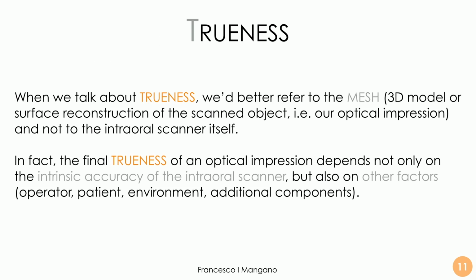And when we talk about trueness, we had better refer to the mesh instead of the intraoral scanner itself, because obviously there can also be deviations, some kind of standard deviation, among the different meshes of the different objects captured with the same intraoral scanner. So it's very important to say that the final trueness of an optical impression, of a mesh, of a 3D surface reconstruction, depends not only on the intrinsic accuracy of the intraoral scanner. Of course, it depends on the scanner, but not only.